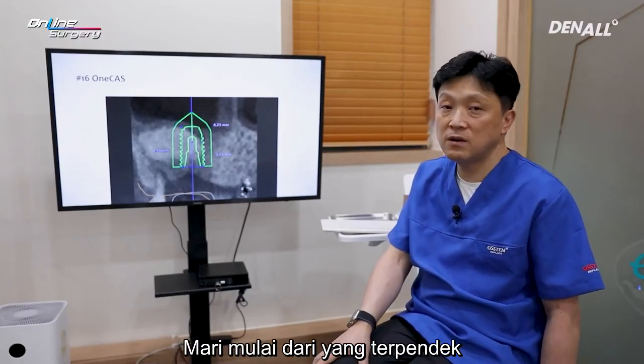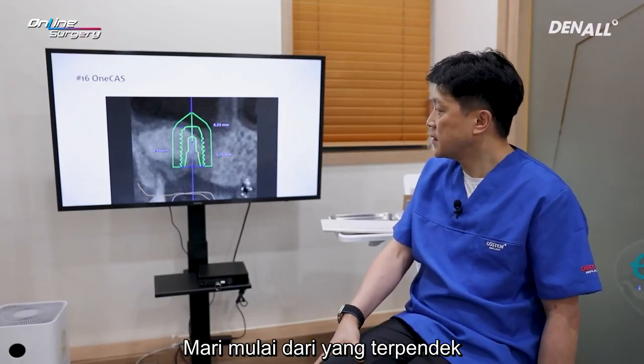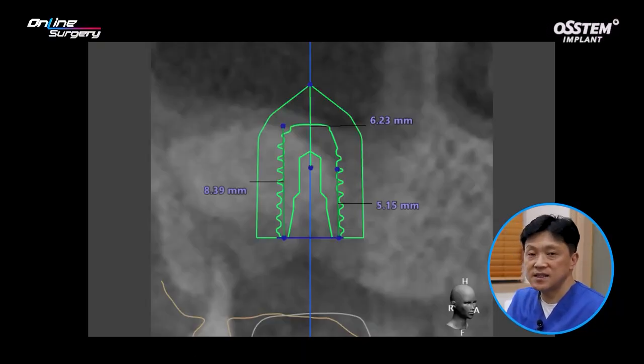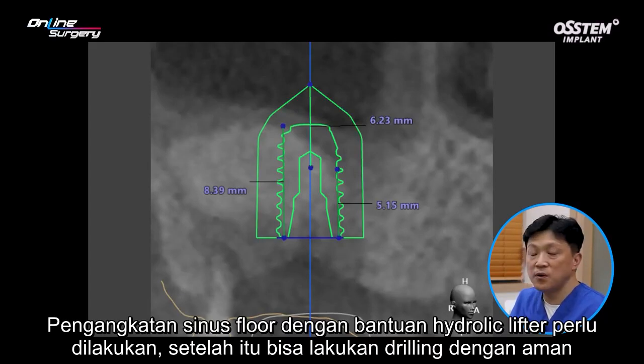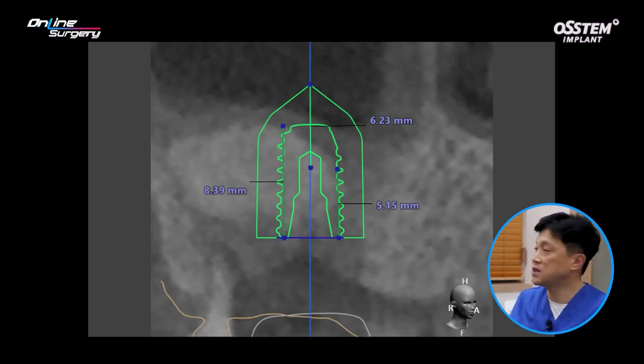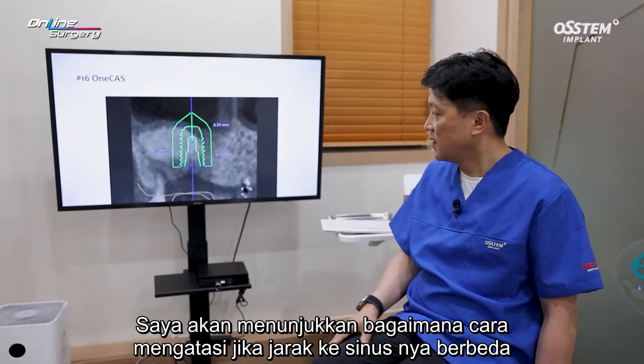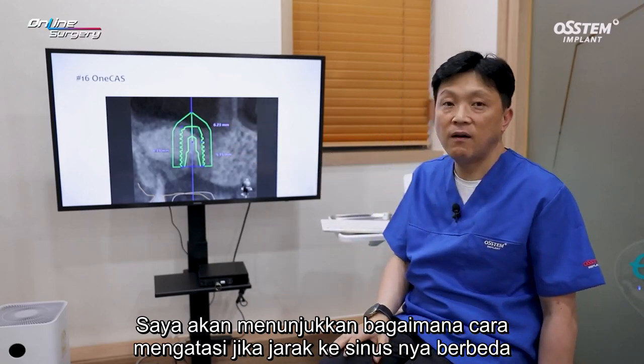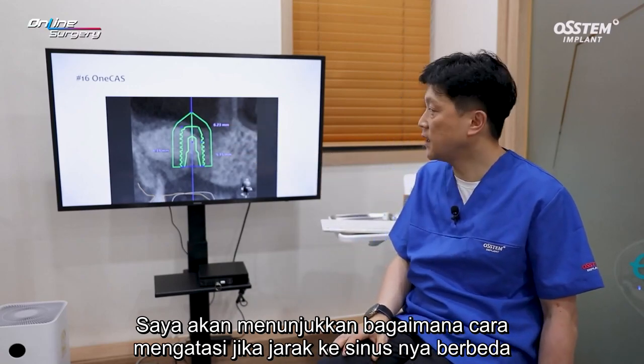In this case, we need to start with the short one first. Partial perforation should be done. Sinus floor elevation followed by hydraulic lift should be done. After that, you can do full depth drilling. That is the safe way to move forward. I want to show you through this surgical clip how to proceed when the distance to the sinus differs.